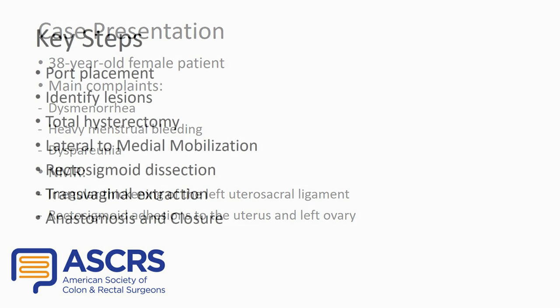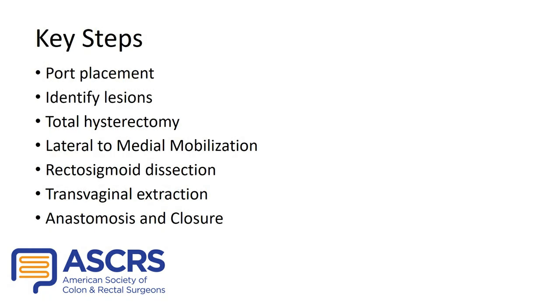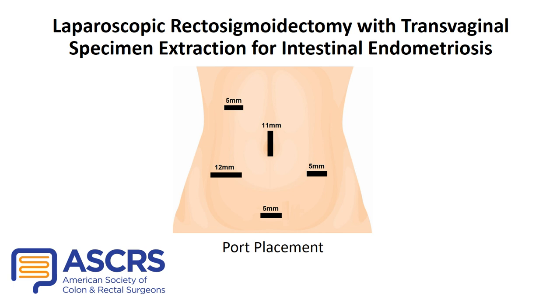A surgical approach was chosen to treat endometriosis. The main steps are: port placement, identify endometriotic lesions, total hysterectomy with transvaginal extraction, left paracolic gutter mobilization, splenic flexure partial mobilization, medial and posterior rectosigmoid dissection, transvaginal extraction of the intestinal segment, anastomosis, intraoperative air leak test, and closure. Here is the usual port placement for intestinal endometriosis.